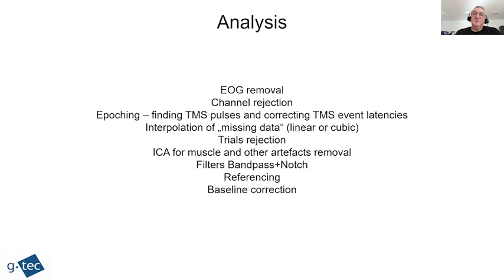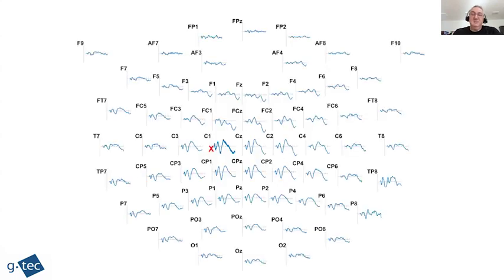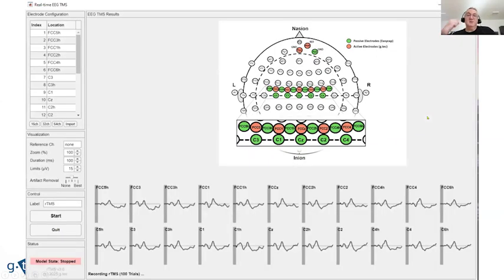That is also a time-consuming process. And when you perform everything, this is the previous recording, and as you can see, we have a very nice evoked potential obtained from the subject. And this is just a note that we have done extensive testing of our active electrodes. So we were using some passive electrodes and some active electrodes.